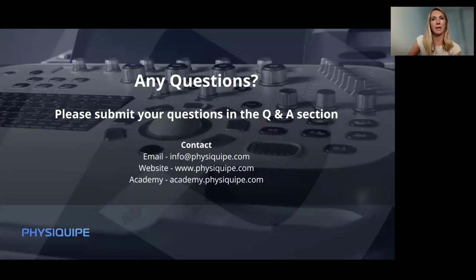And you mentioned that dynamic assessment quite a bit as well. So you do recommend doing that as much as you can? Absolutely. And for learning as well, use that dynamic aspect. It can be a little bit fiddly. Particularly if you're looking at the MCL and you're trying with one hand to put dynamic valgus in the knee, it can be a bit tricky. So it just comes with a lot of practice. But dynamic assessment can be really helpful. Okay, that's a good tip.